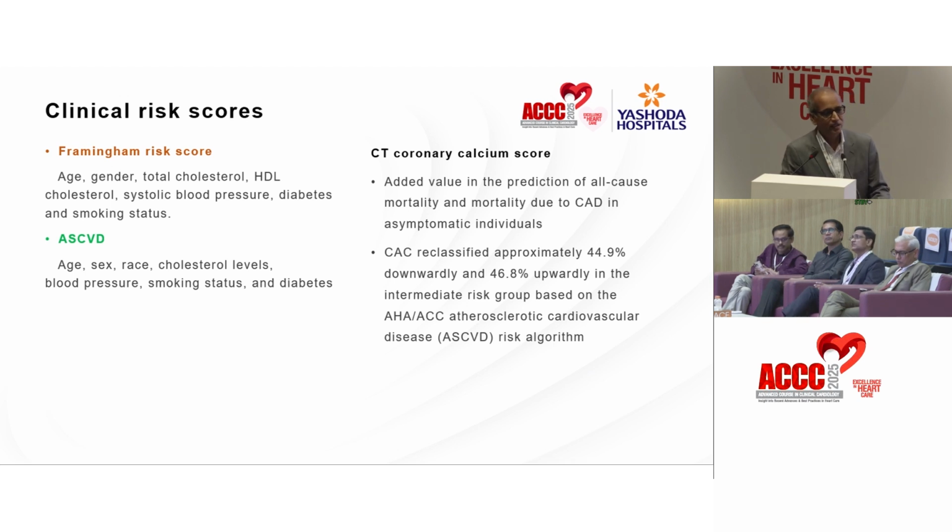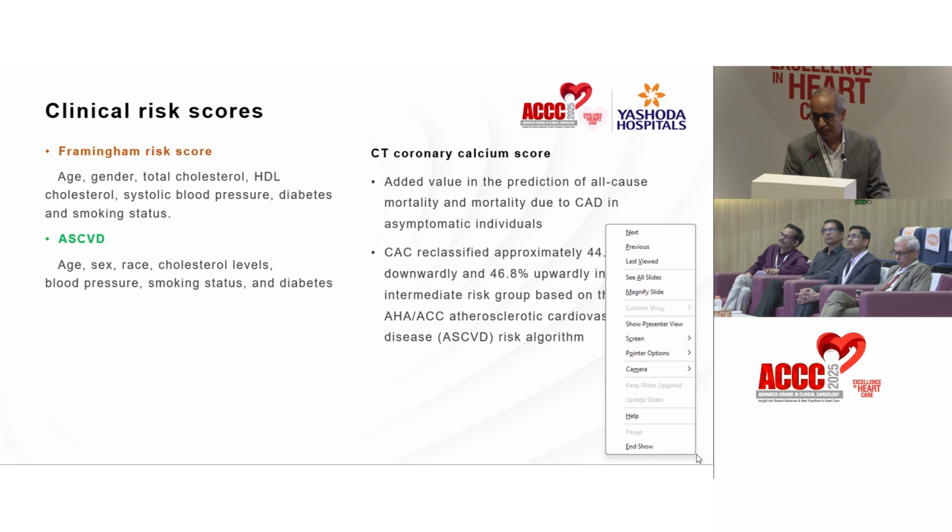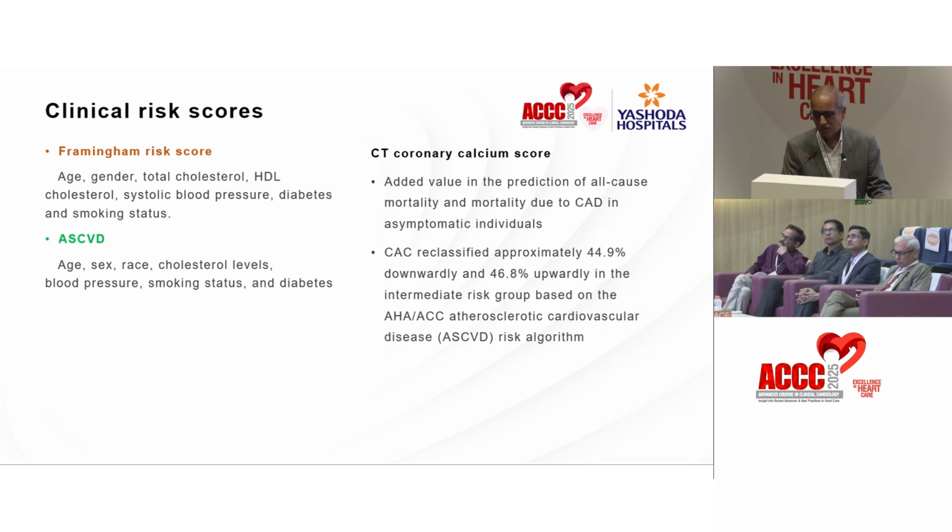So if we add another indicator, such as a calcium score, which is done on a non-contrast gated CT, studies have proven that all-cause mortality and morbidity in CAD individuals, the prediction can be much better than if you use a clinical score alone. And coronary calcium score has reclassified a significant proportion of patients. It has either downgraded or upgraded the risk when you added the calcium score to the clinical scores in up to 45% of individuals, especially in asymptomatic CAD disease.